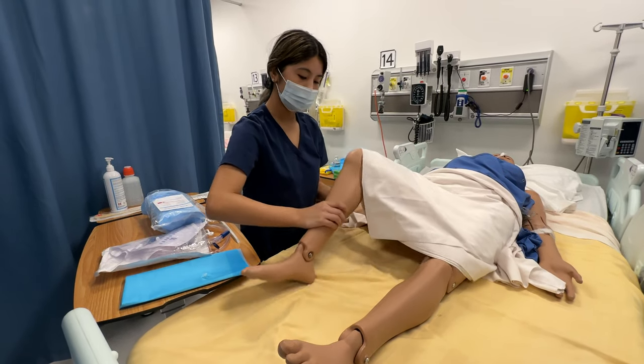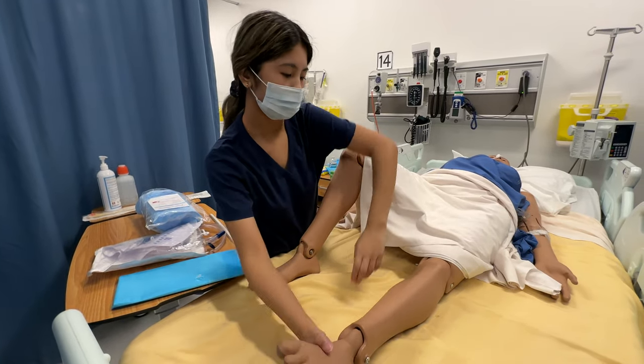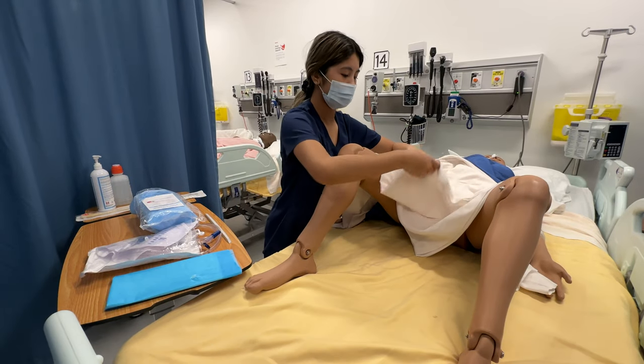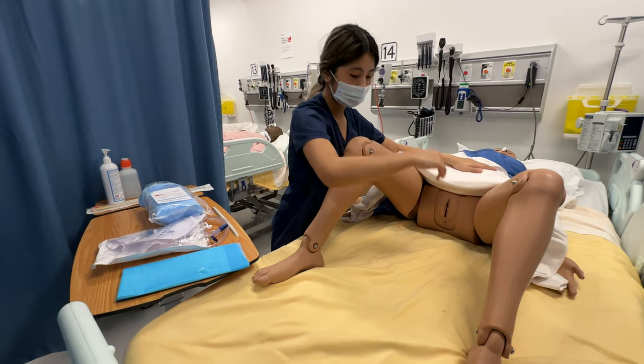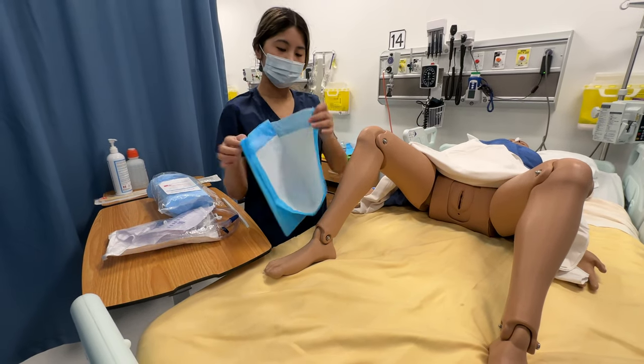Okay, and then I'm going to place you in a dorsal recumbent position. And then I'm just going to place this drape underneath of you.